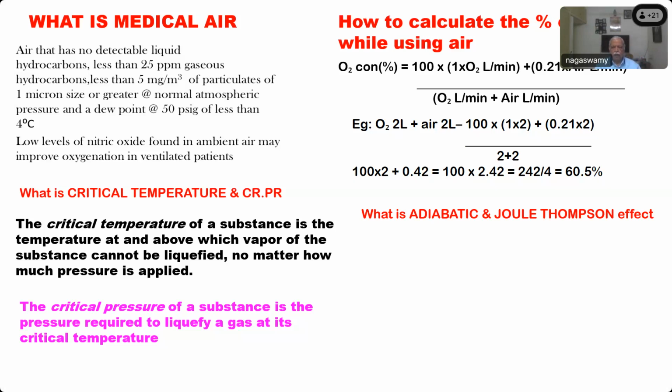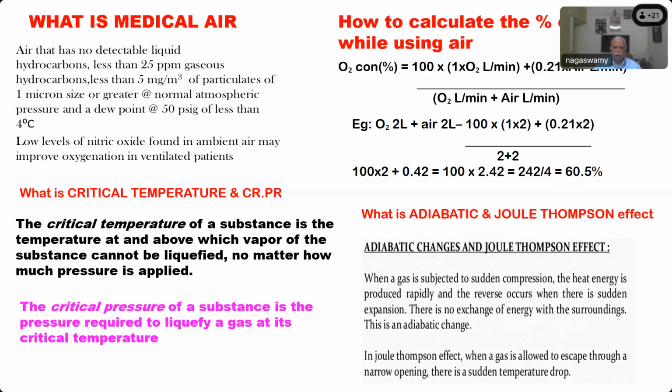When you use a nitrous oxide cylinder and open the stem of the nitrous oxide cylinder, and the valve releases the nitrous oxide gas vapor, what will happen? There will be a drop in temperature of the surrounding air. It will take the heat from the surrounding air to vaporize the liquid, and that will cause a reduction in the temperature, and water vapor in the air surrounding the valve will condense and form frost around the valve block. So that is what is called the Joule-Thomson effect.